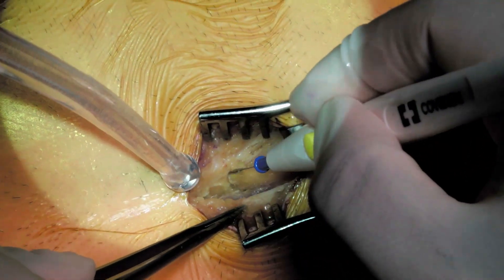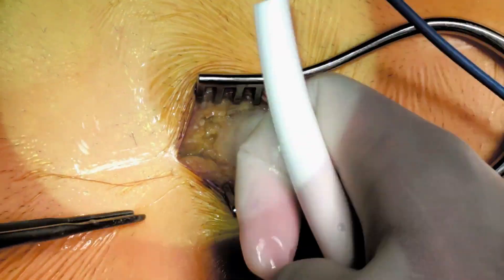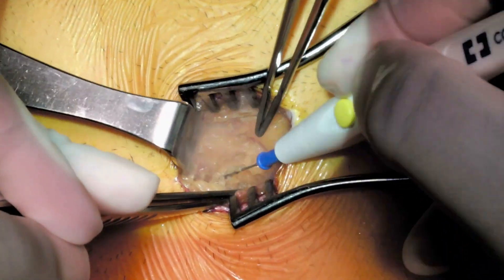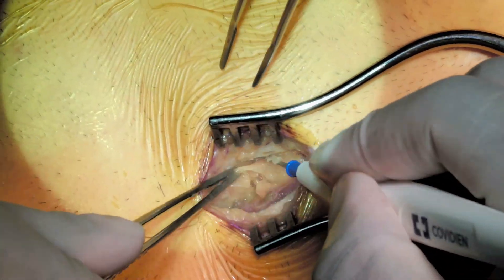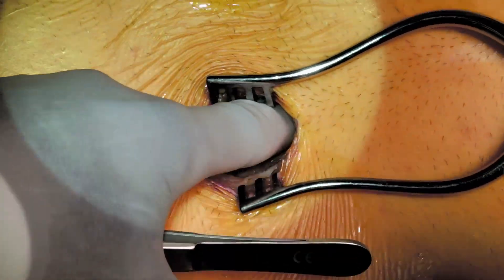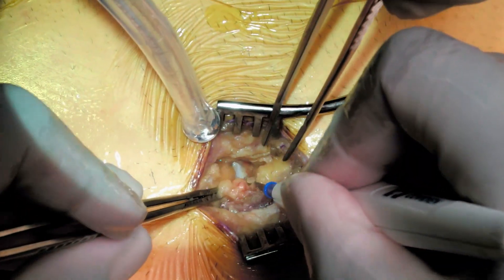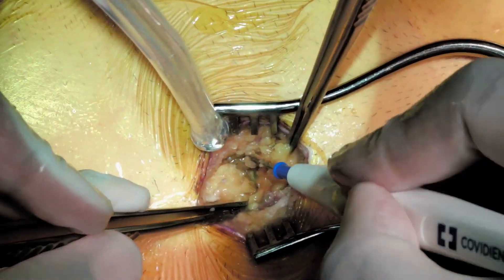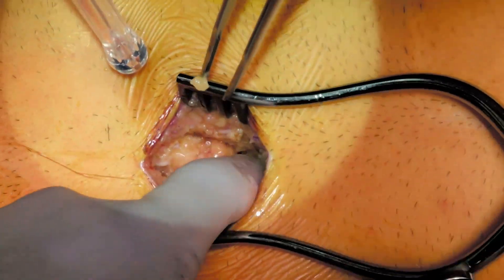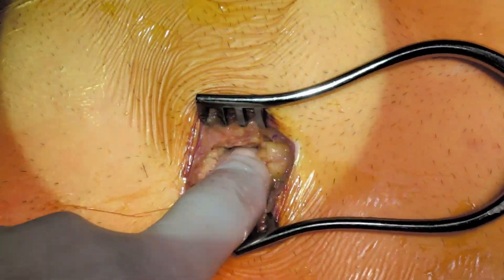I've divided through the subcutaneous tissue, muscle, and now you're going to see some fat. I use a combination of my finger and electrocautery to mobilize and separate the tissue. When I'm using my finger, I'm trying to feel the xiphoid process — and now I'm getting down to it, that's the tissue below the fat. I use my finger to mobilize the xiphoid because I know I'm not going to injure the heart, which is underneath the xiphoid process.